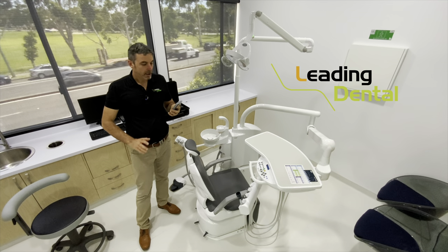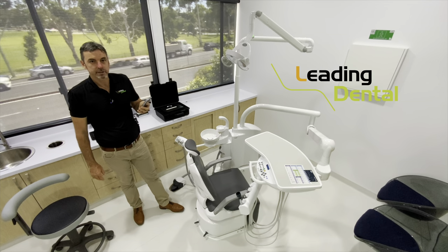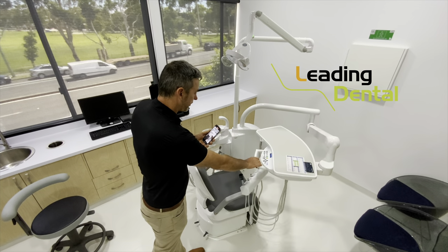What's up, Steve here, Leading Dental. Today we're going to do an in-service on the Belmont Clashair, which is the knee-grade chair here from Belmont. So we're going to go through some of the main features and functions.